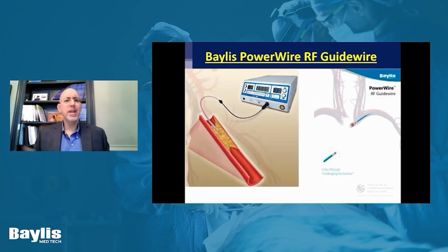So what's wrong with needles alone? Whether it's jugular needles, transjugular TIPS needles, or Chiba needles or transeptal needles, they really have very little directionality. Even a TIPS needle you can torque, but it doesn't have as fine a correction as something else, and that's the Baylis PowerWire.